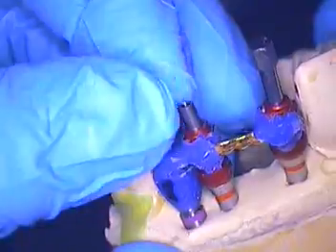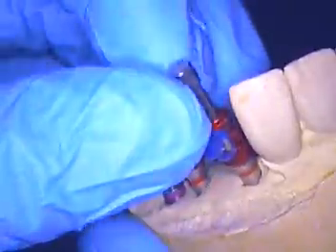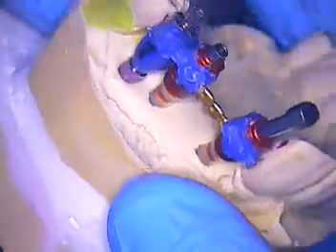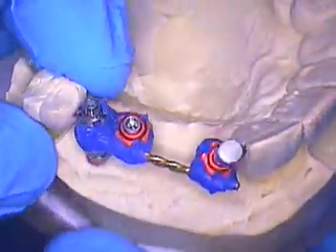From what I understand, even with the all-on-fours out there, labs want to give you some type of try-in jig. If you do it this way, it's no mess and it's easy to do in the mouth. I have other videos that show you exactly how to do this — what to buy, how to assemble it. Zooming in, you can see there is absolutely no seam whatsoever on any of these implants. Everything just bottomed out perfectly. A year or two later, the case is as rigid and rock solid as the day I assembled it. Stability is key.